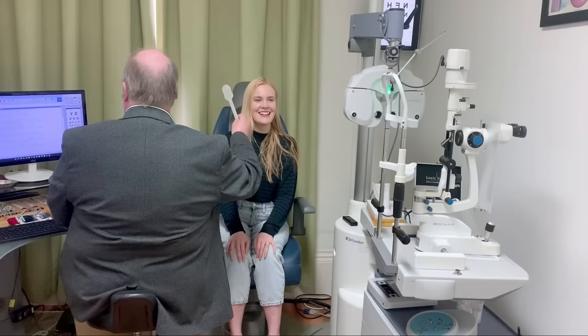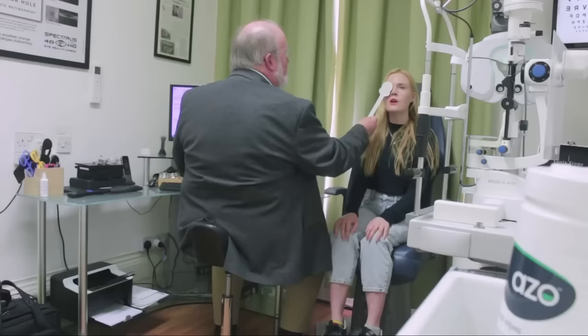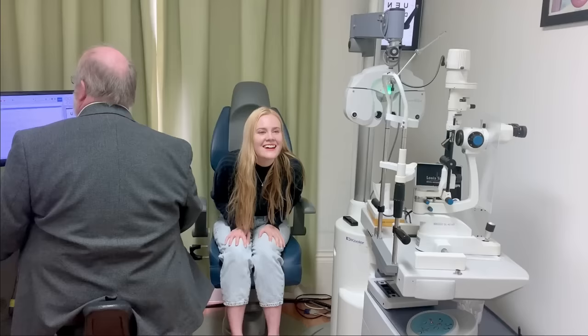Let's cover this now. Swap the letters over, okay? So have a peek there. And what can you manage down to for me? U, R on the top. U, E, N. Then U, E, N, is that a V or an M? V, okay. D, F, V, R, E. Well done. And the next one? Maybe an F. Okay. N. F. Okay. O, F. Okay, bits and bobs. All right. One of them was an F, I guess. Yeah, one of them was an F.